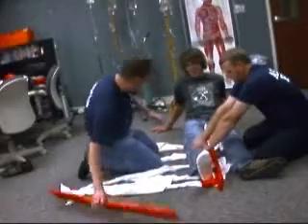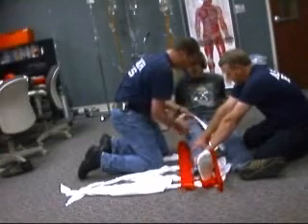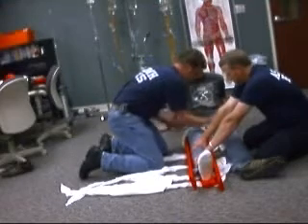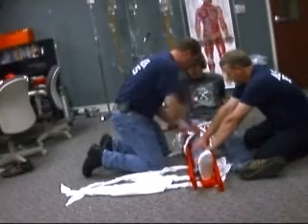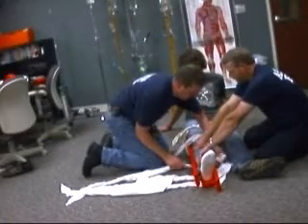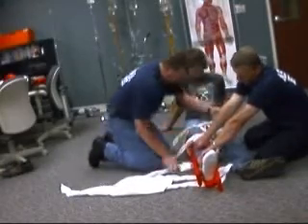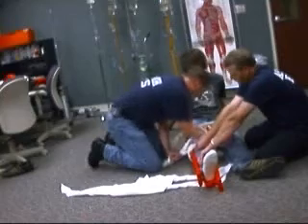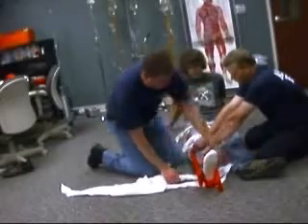I'm going to put the splint between the legs with padding, and a splint on the outside of the leg. We're going to begin securing the splint to the leg — one strap on the upper thigh, one above the knee, and one below the knee.